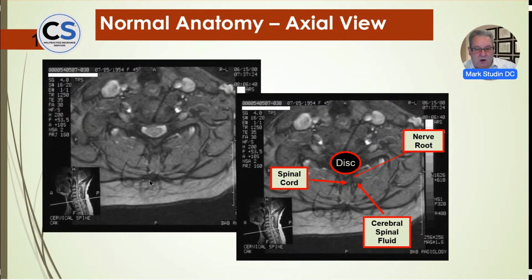And in our world, we're never going to use contrast. Let me rephrase it. We're rarely going to use contrast. Contrast is for post-surgical MRIs. Contrast is when you're defining tumors and other issues. In our world, you need an appropriate number of sequences and slice thicknesses. That's critical. And we're not going to really have an opportunity to talk about sequencing today or in the next conversation.